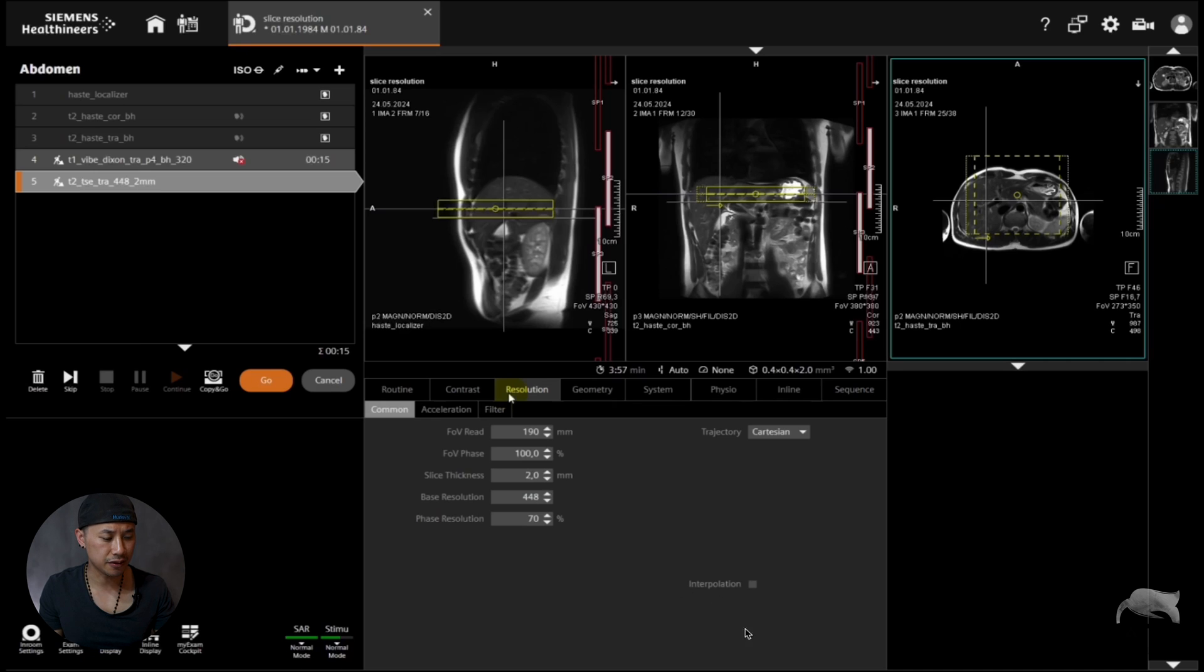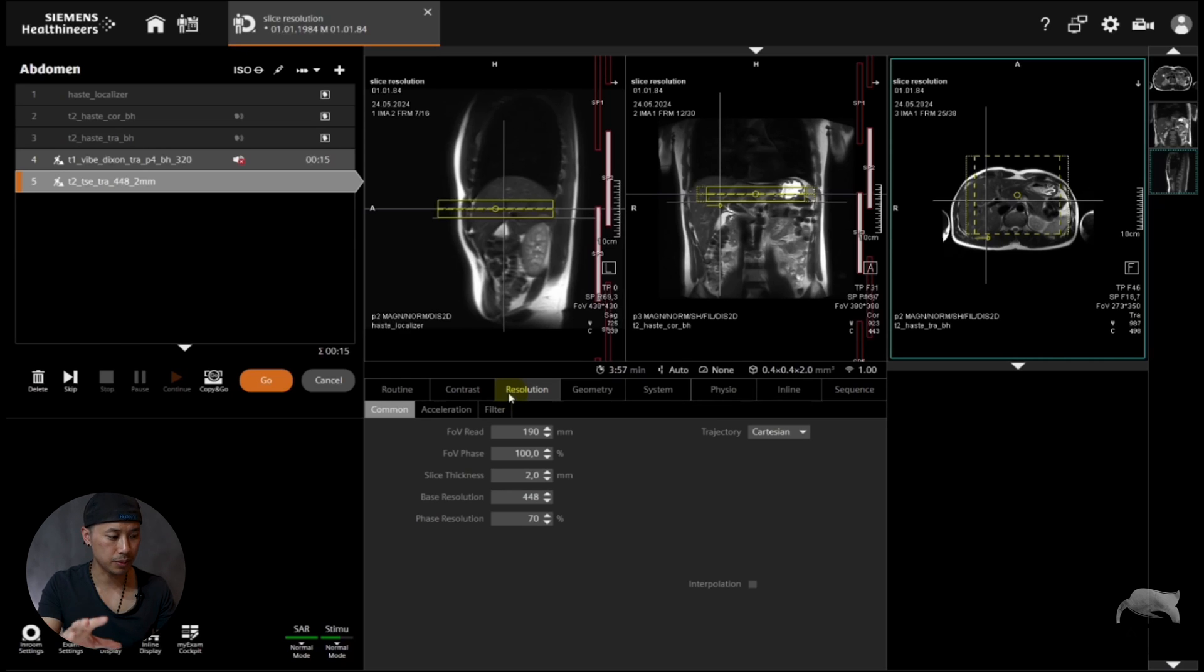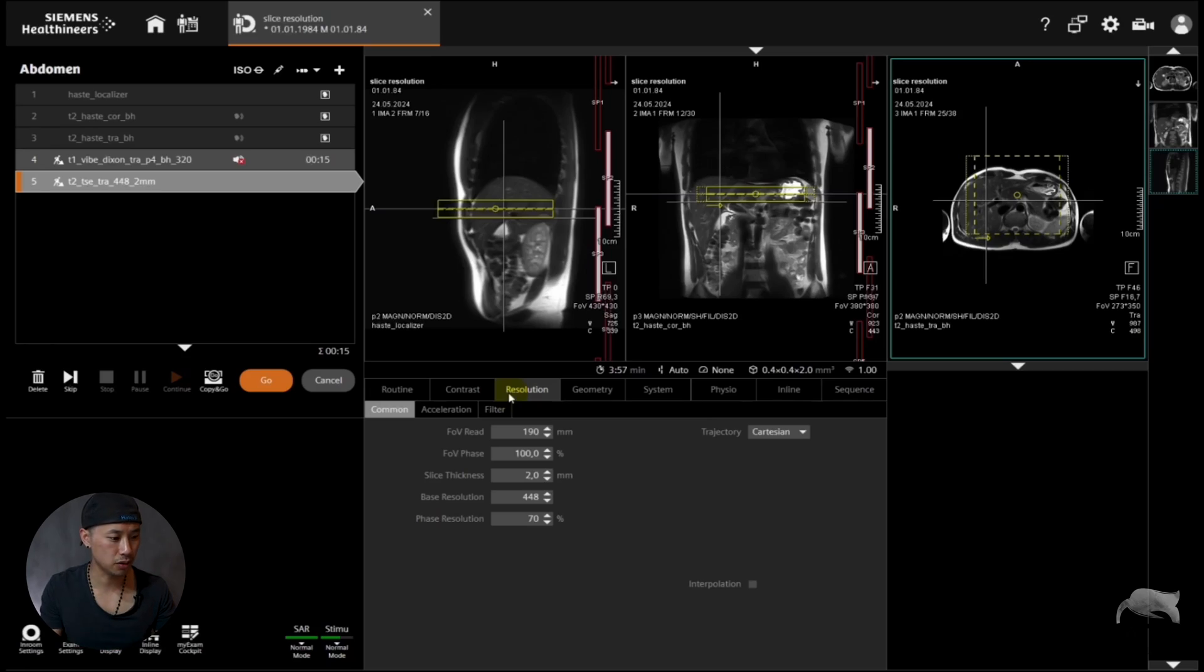As you go to resolution there's no slice resolution here. And this interpolation function right here is only working on the phase encoding and the frequency encoding, not on the slice. So the 2 millimeter here is 2 millimeter. There's no interpolation on that 2 millimeter at all.